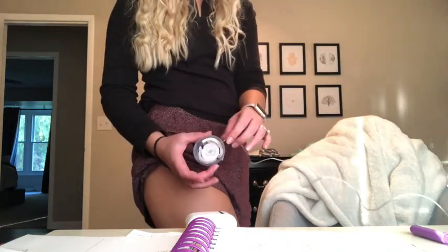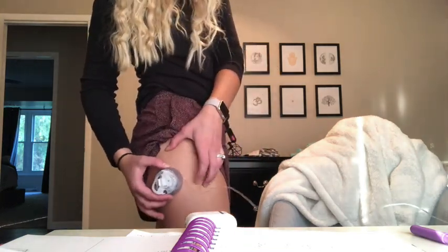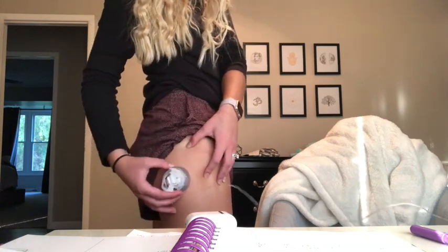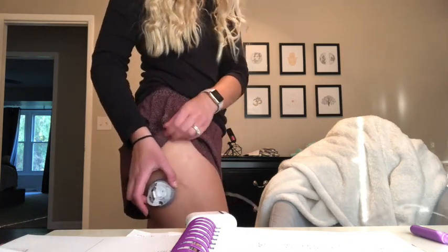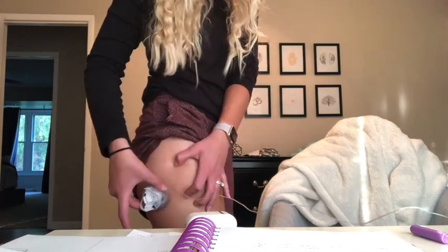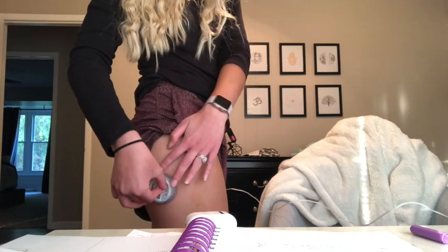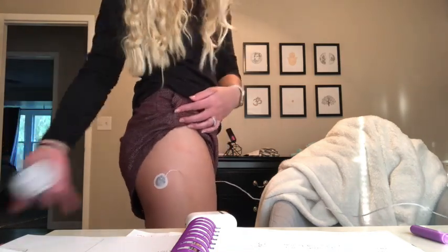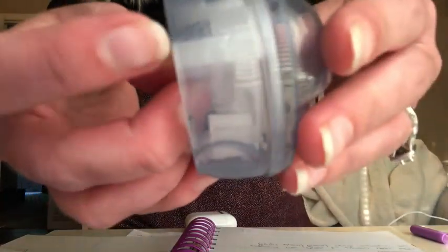Dry it. Okay, so then I take my insertion site by the lined edges and press it where I'm gonna put my site. And I move my hands around to the button area where you press the site in. Okay, so after you press it in, I just press down on the middle a little bit and then pull straight out. And then the site is in. I take the insertion site and just cover it up with that lid that it came with. And then I go back to my pump.